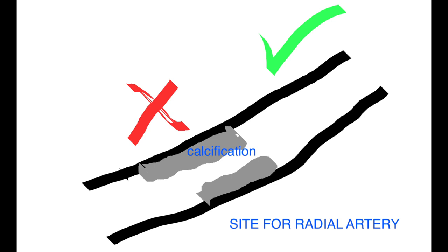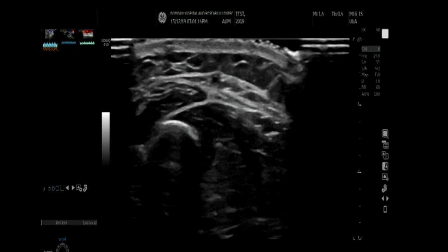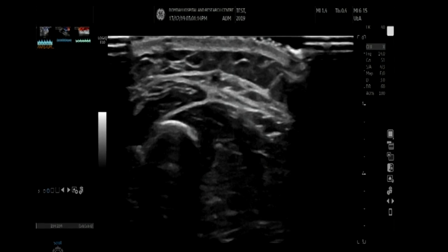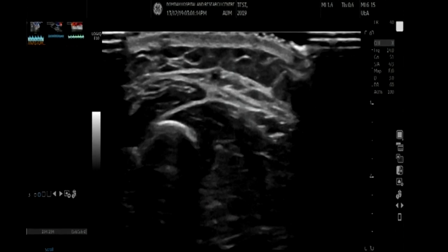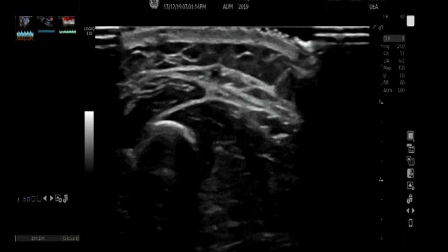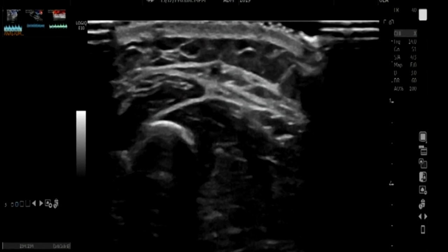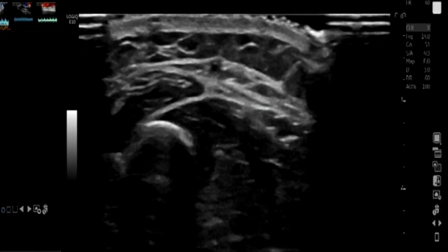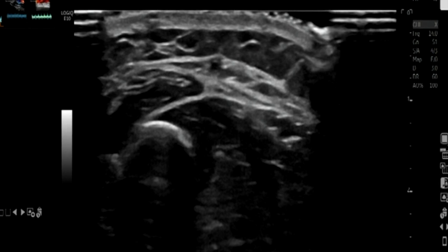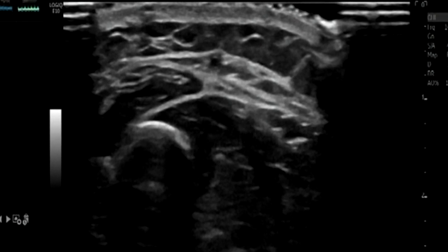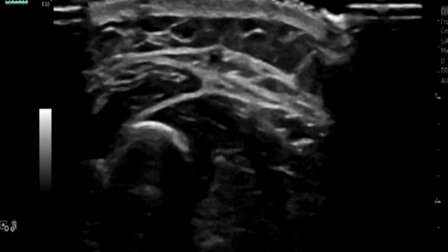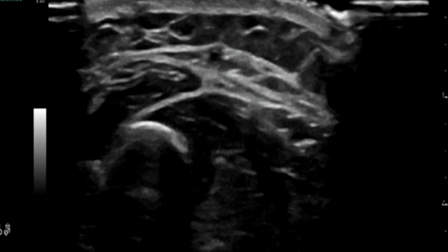Be careful not to mark an area with patchy atherosclerotic calcification, as anastomosis becomes difficult for the surgeon where the artery is calcified and the procedure may have to be abandoned. This is especially a problem in females — they are frail, weakened by chronic renal failure, and undergoing repeated hemodialysis. Even veins as small as two millimeters should be marked and given a chance, provided there is a fairly good healthy artery feeding the vein, as a fistula can still be successfully constructed.